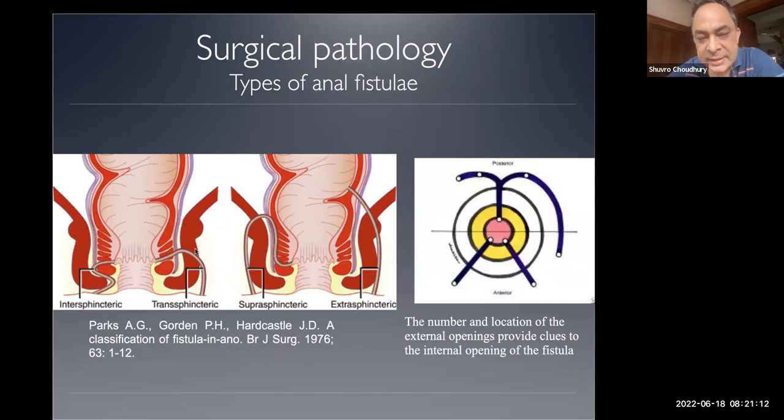And the reason for recurrence of perianal fistula is, like you said, inadequate curettage of the side extension, because then you have a residual sepsis in that side extension, and that continues to give a recurrence. So we need to understand this is the primary tract.